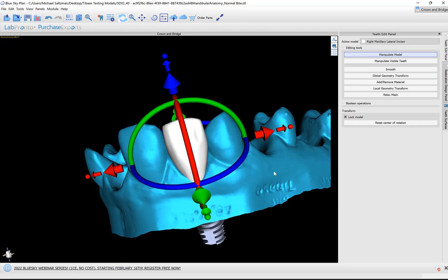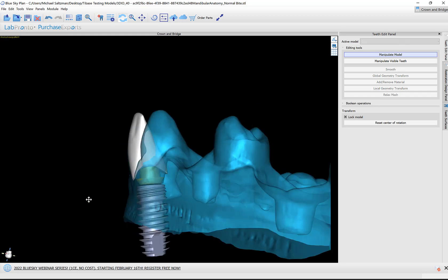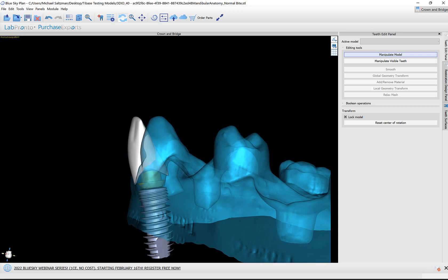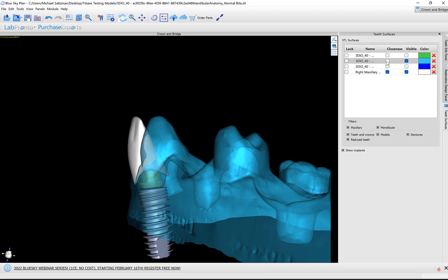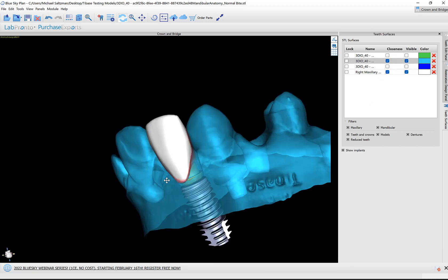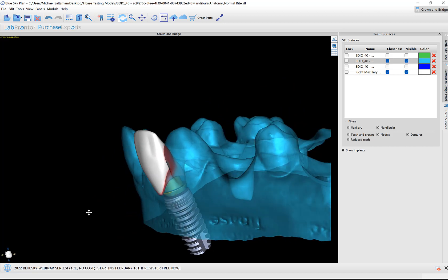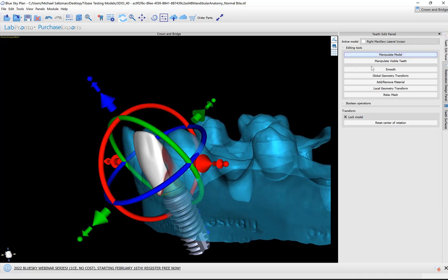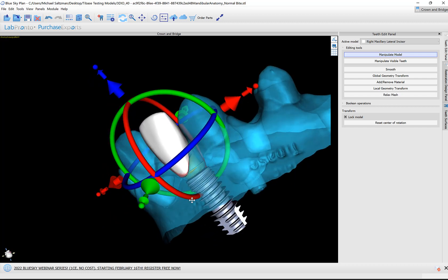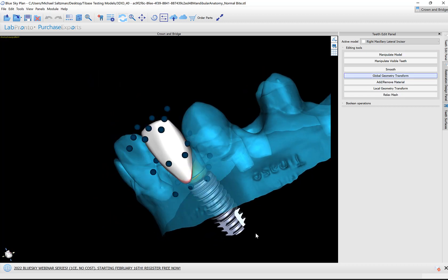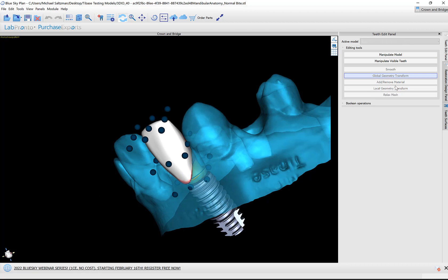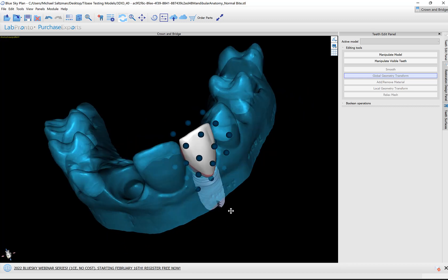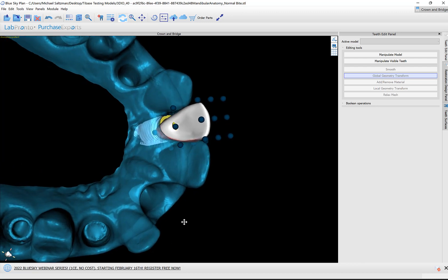What we could also do is right-click on the model and click toggle transparency, then you're able to see through the model. We could also turn on closeness. We could check the closeness box and the software shows us in red our intersections. We could use our global geometry transform, our local geometry transform.